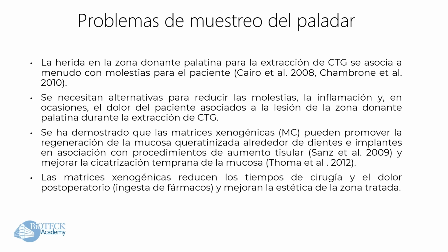Indeed, this summarizes that the donor site, the palate, from which the connective tissue graft is extracted, is associated with more complications for the patient, and so we need an alternative to reduce this pain and inflammation, and to avoid the lesion of the palate harvesting.